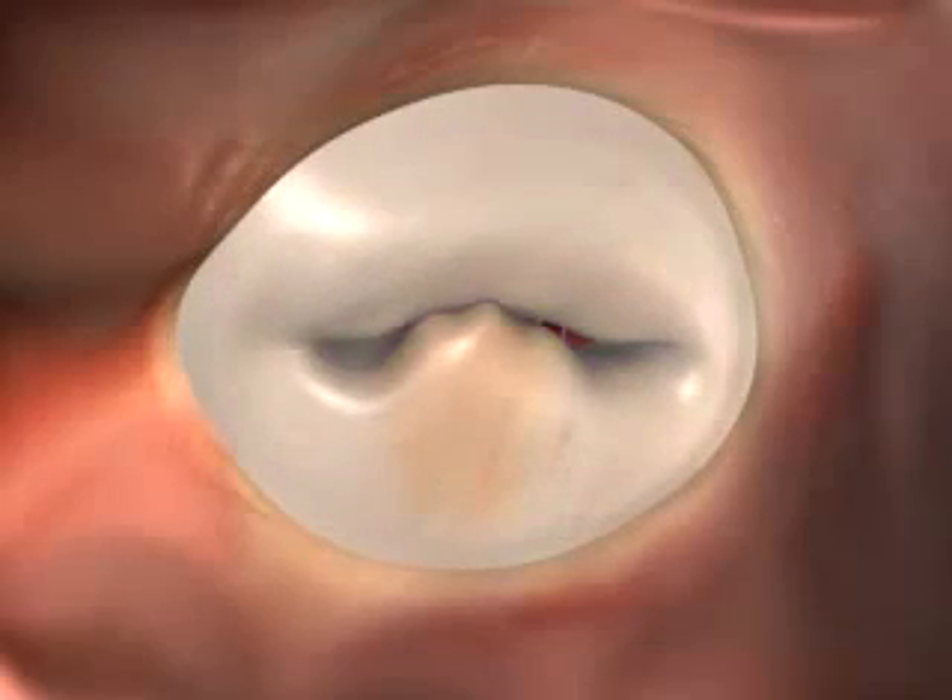We see that the valve is oversized, misshapen, and doesn't close properly, which allows blood to leak backwards.